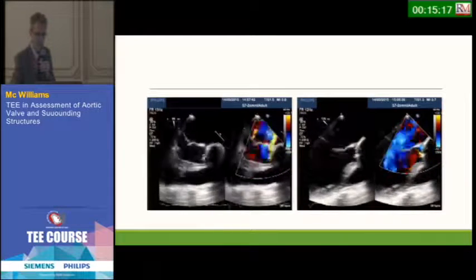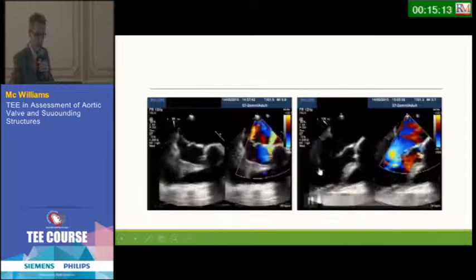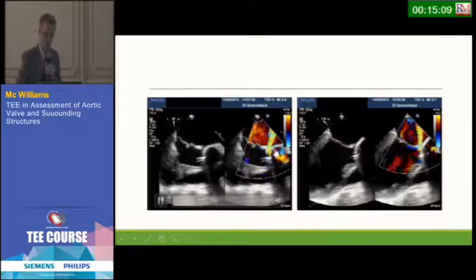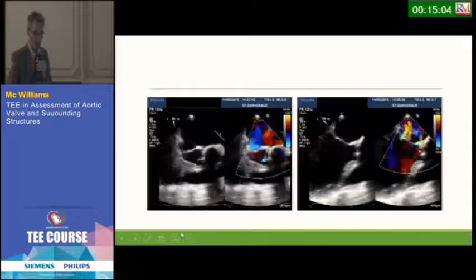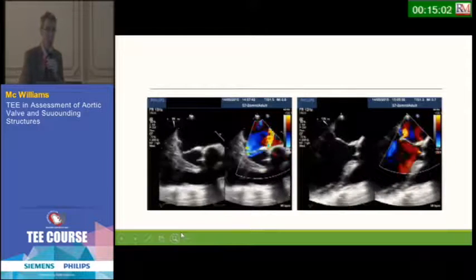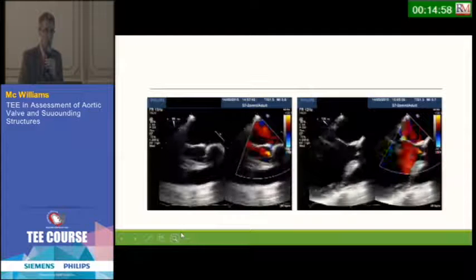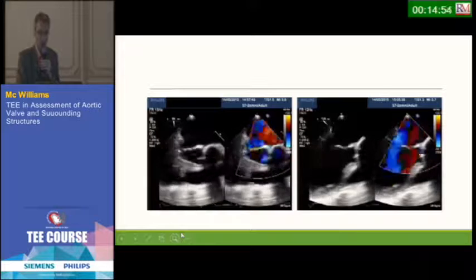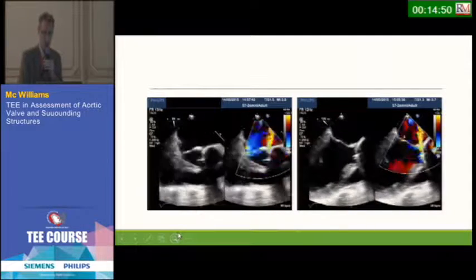This is the anterior mitral leaflet. And just at the connection between the anterior mitral leaflet and the aortic continuity, this jet is visible. So the jet is actually coming through just below the aortic valve, and the aortomitral fibrous continuity. You can see a little whiff of aortic regurgitation, the actual repair of the mitral regurgitation.